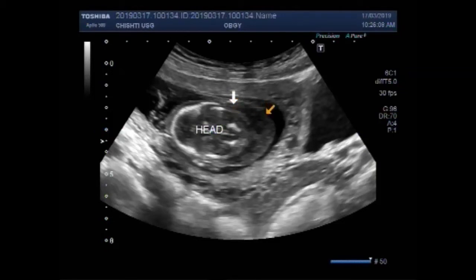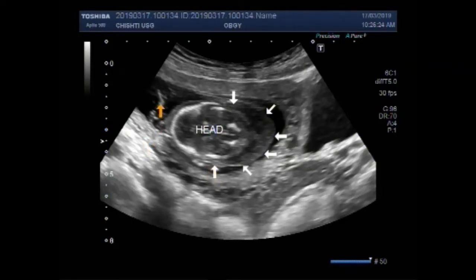The pregnancy measures about 14 to 15 weeks, and you can see all around the fetal head there is soft tissue edema. This is the soft tissue edema around the fetal head.